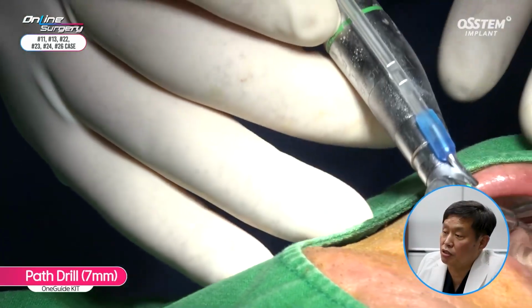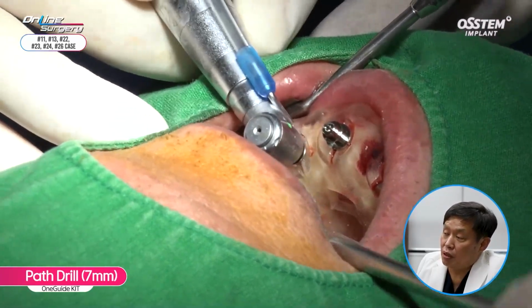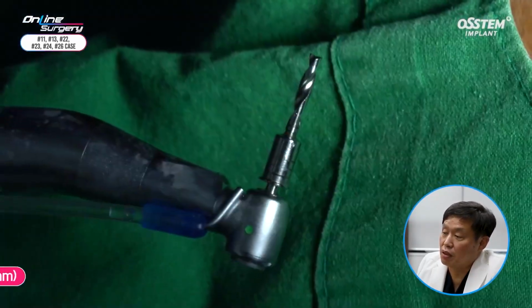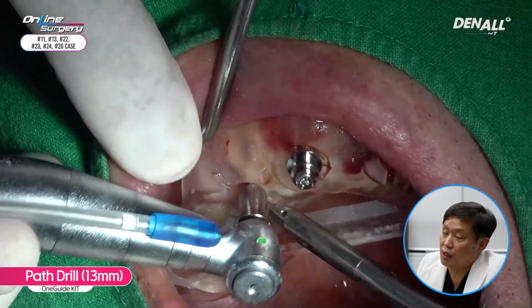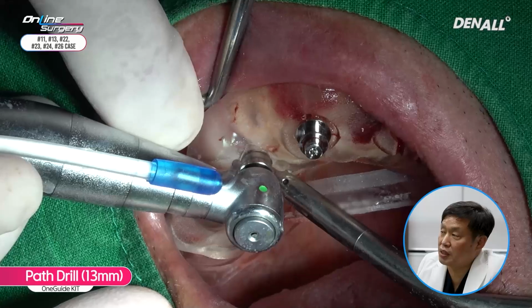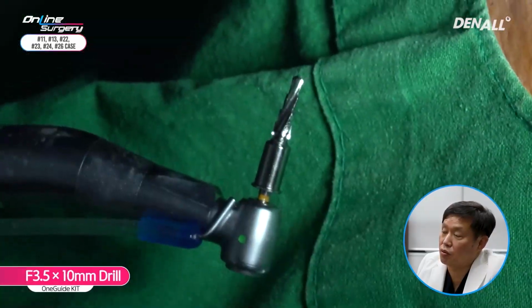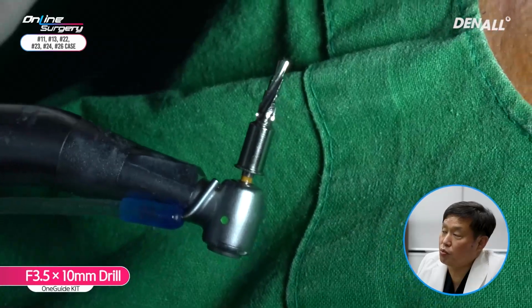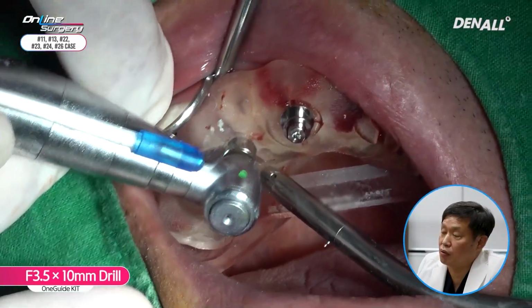The alveolar bone was slightly sloped. In order to prevent any slipping, path drill was used. 7 mm path drill was used first, followed by 13 mm path drill. In the canine area, path drill was used up to 10 mm, and then 3.5 by 10 mm OneGuide drill was used.